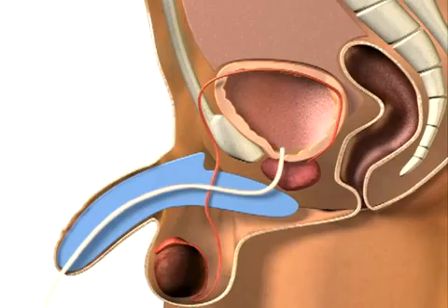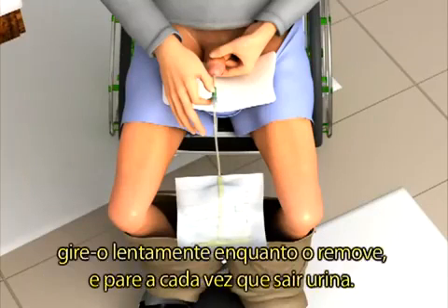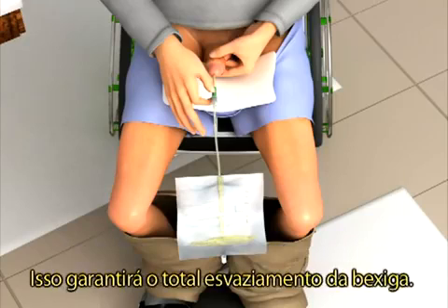If you use a regular catheter with a straight tip, it is recommended that you slowly rotate the catheter as you withdraw it and stop each time more urine drains out. This is to ensure complete emptying of the bladder.